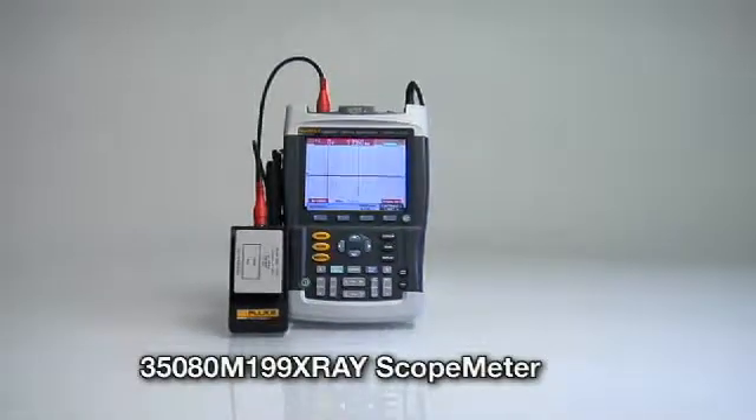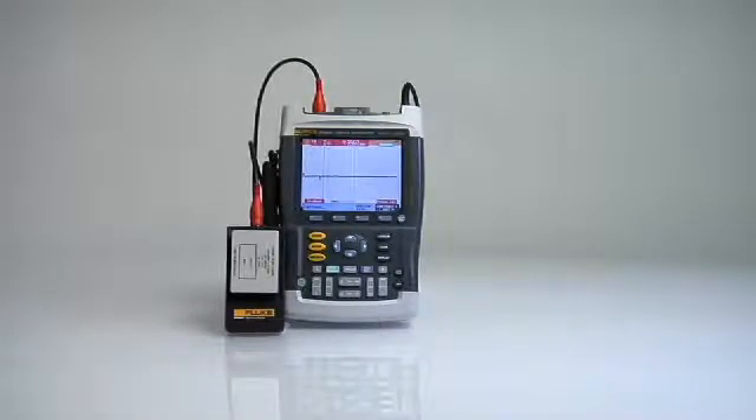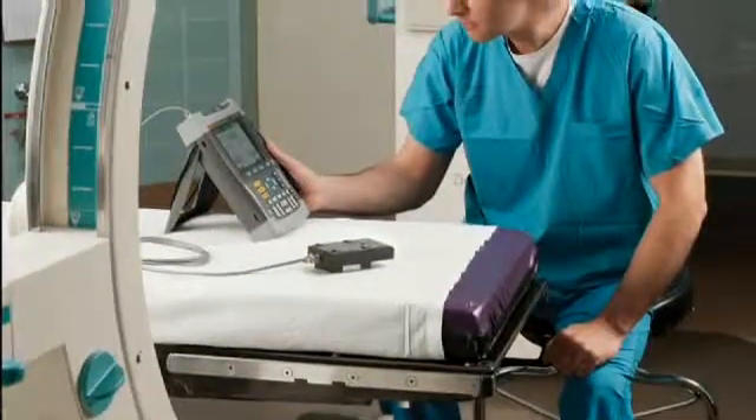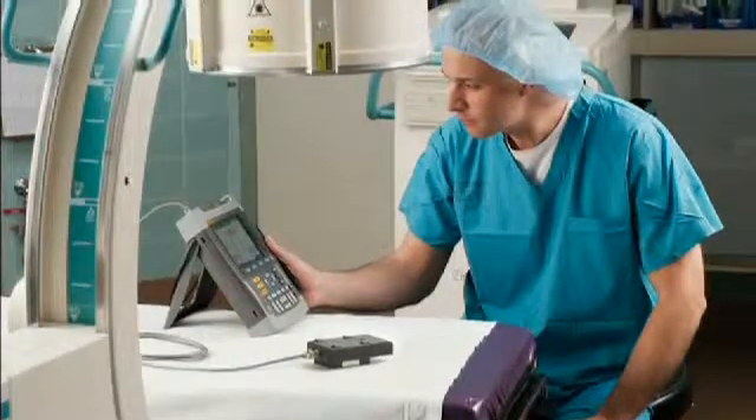The 35080M-199 X-ray Scope Meter is a new merger of Fluke Biomedical Technologies that is particularly valuable for the service or biomedical engineer to perform calibration or preventive maintenance.